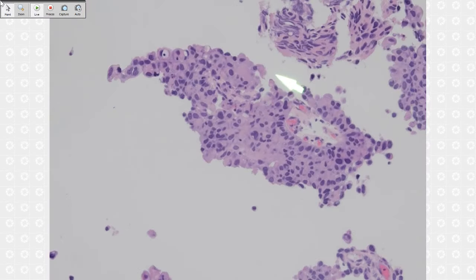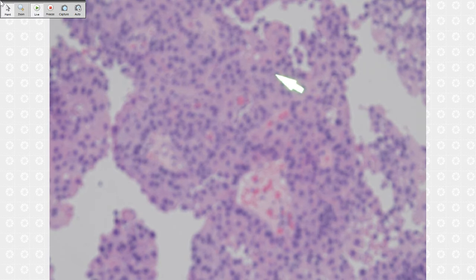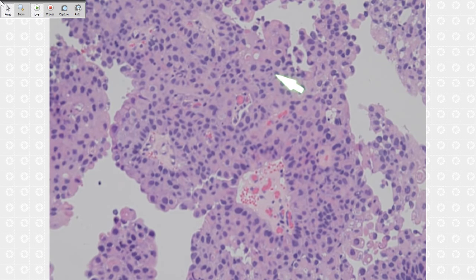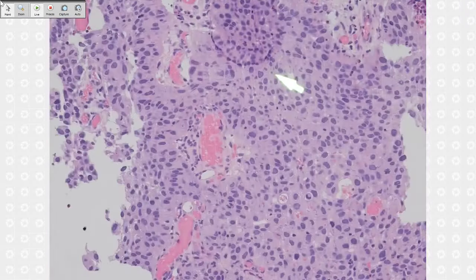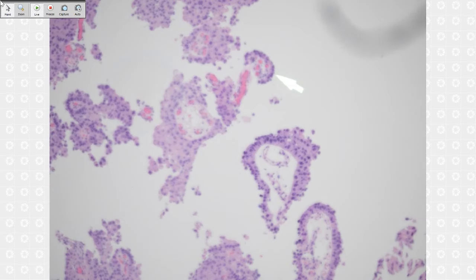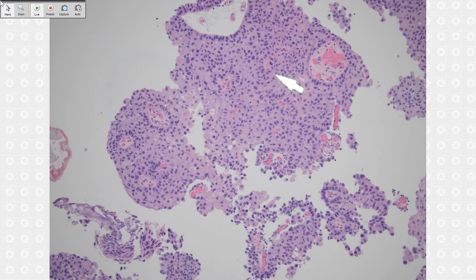So this one we should call high grade. What's the difference from that one? Firstly, you see these cells lose cohesion and start spreading. Another thing, always nuclear atypia there, right? The cytoplasm is usually eosinophilic looking. If you look carefully, you will obviously see mitotic figures. Next we look for invasion. This one looks very superficial. At least here we didn't see lamina propria invasion, so it's still non-invasive. Don't call this carcinoma in situ, okay?